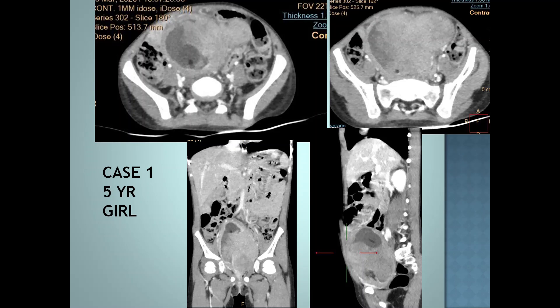This is the first case of a 5-year-old girl who presented with hematuria and dysuria. As we can see, there is an abnormality in the urinary bladder with a large, heterogeneously enhancing, lobulated mass filling the urinary bladder, involving the urinary bladder wall and with perivesical extension.